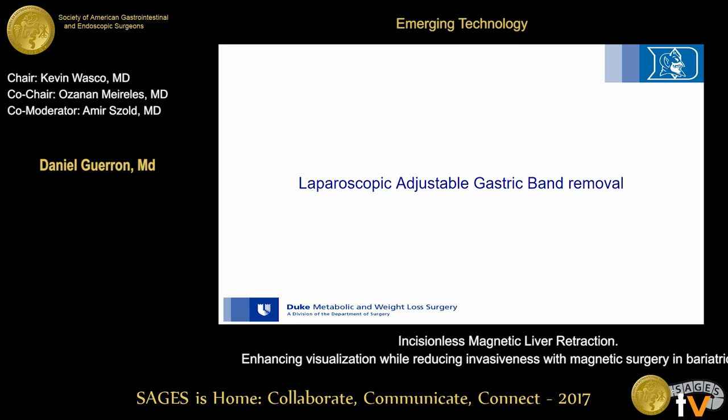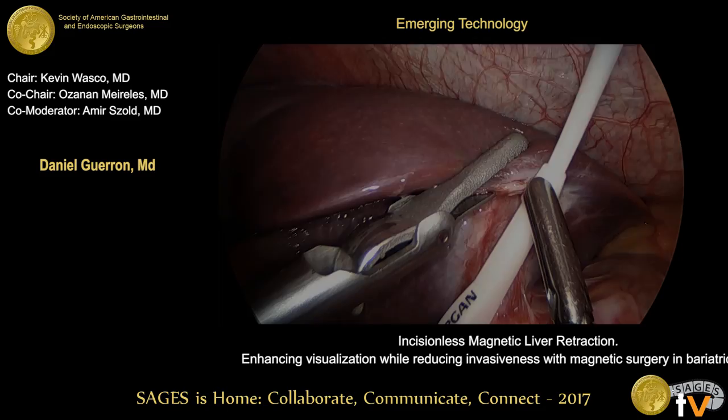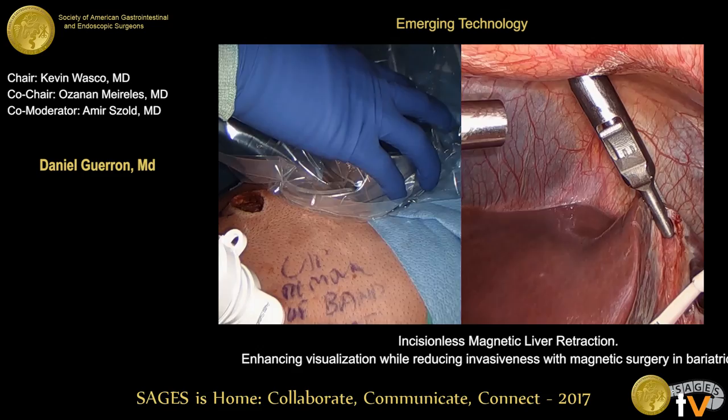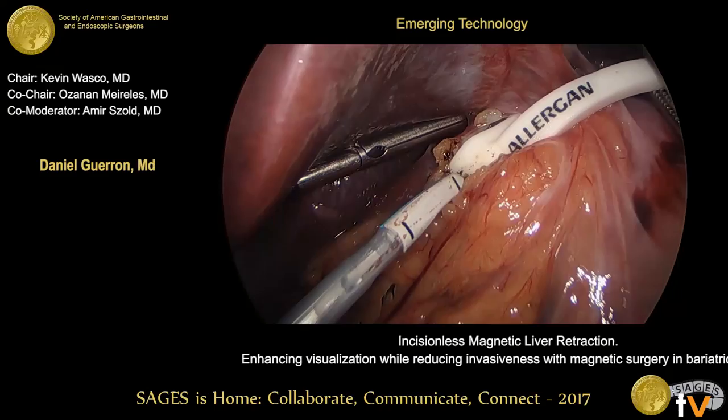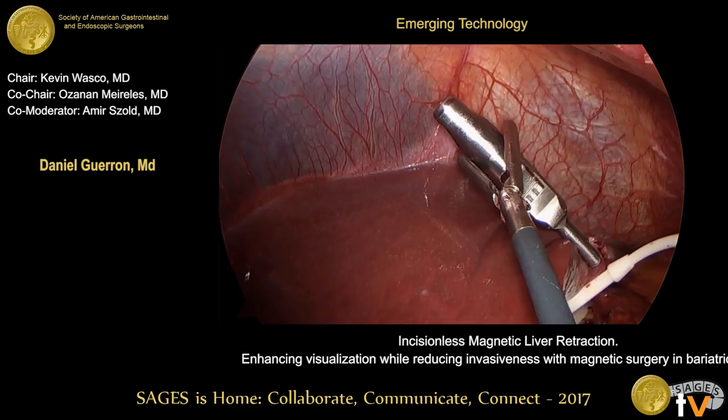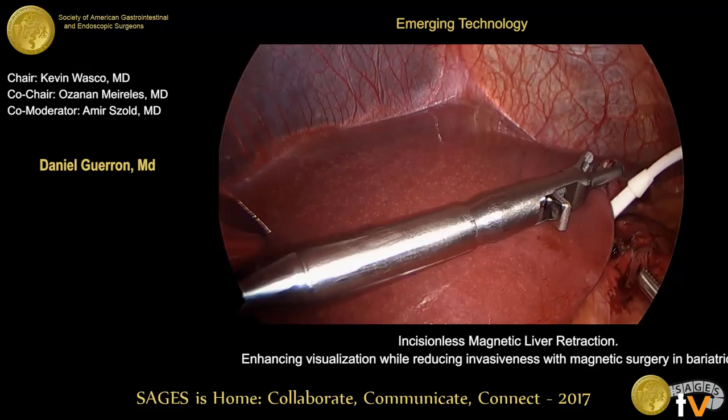In another case, I'll demonstrate the retraction with gastric band removal. Again, the grasper is placed in the liver and coupled to the anterior abdominal wall with the external magnet, as depicted here. With that retraction, we proceed to dissect over the fibrous capsule of the band using electrocautery. Here we demonstrate how easy it is to detach the tip of the grasper and reposition it to another area of the liver to enhance visualization and retraction.